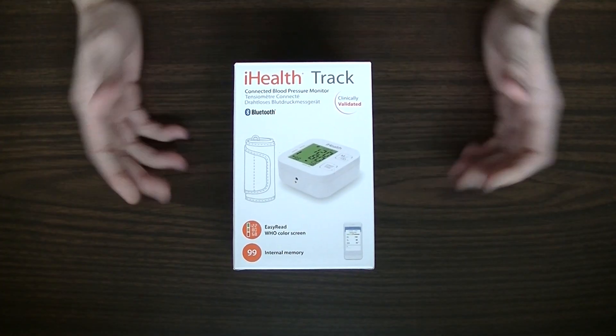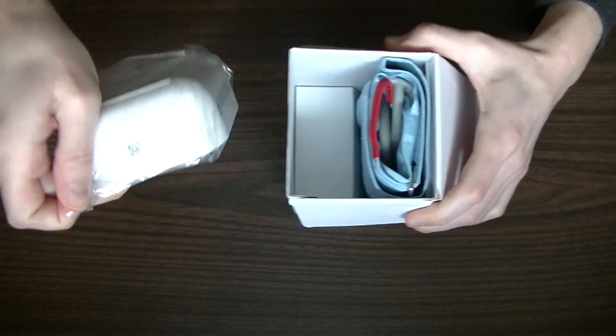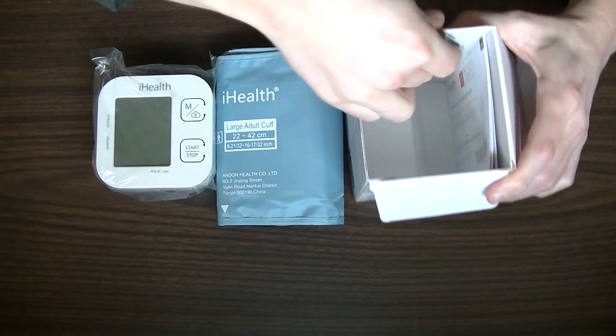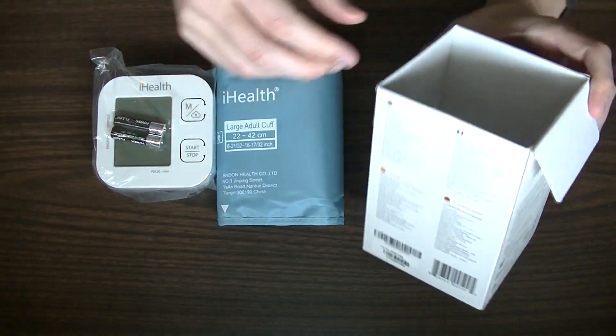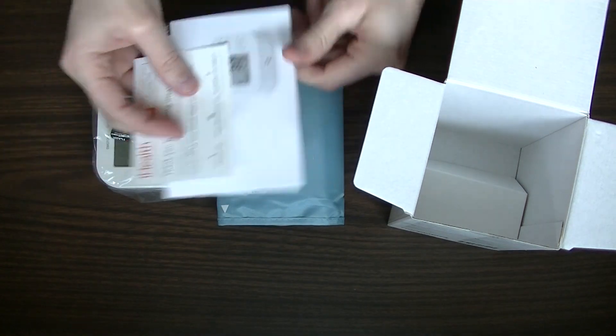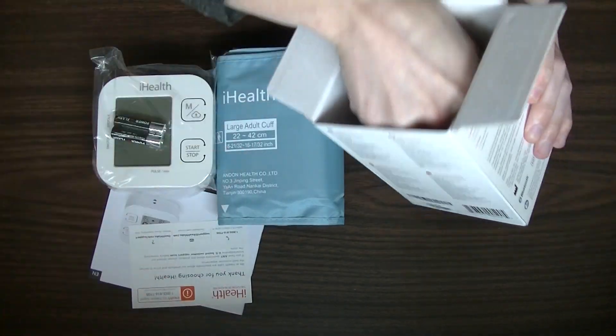When you unbox this, you are going to get the actual health monitor and the pressure cuff, which you put around your arm. I love when companies do this — they include the batteries so you don't have to go buy them. You can pull this thing out of the box, put it together, and it's ready to go.